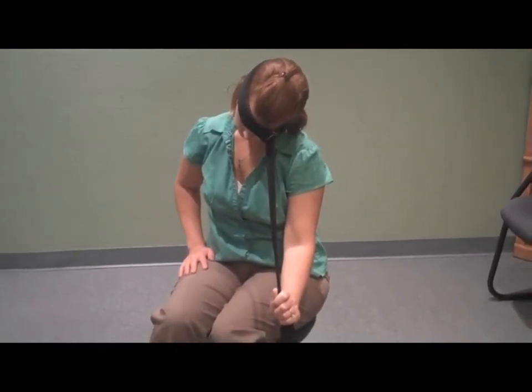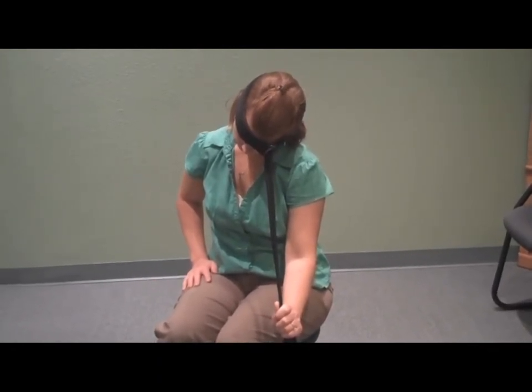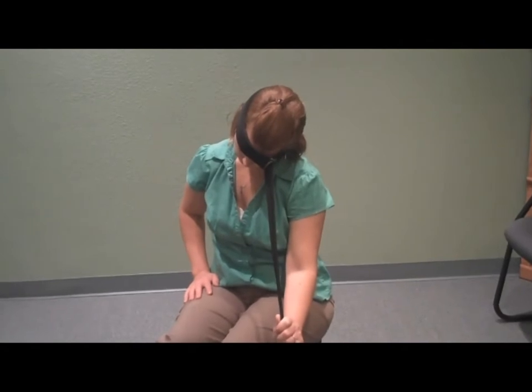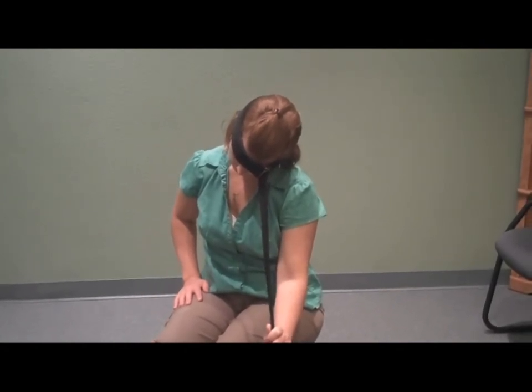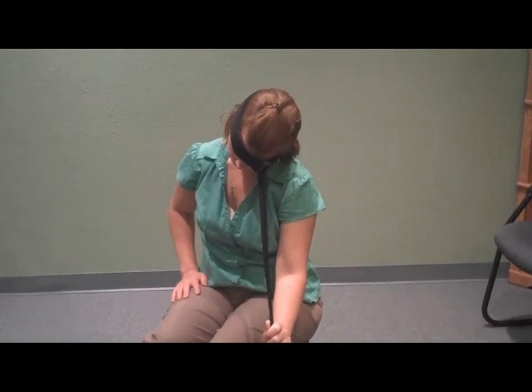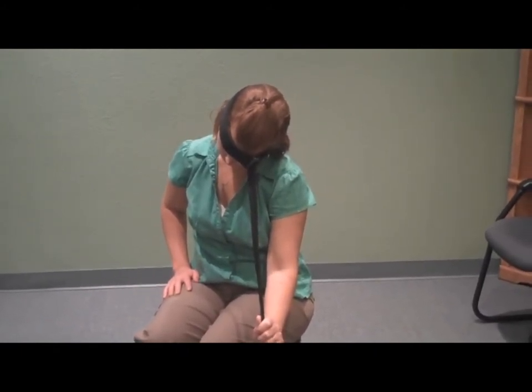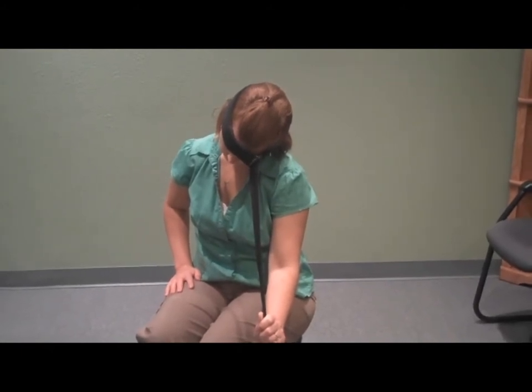You hold it for 40 seconds — 40 seconds is the key for each one of these stretches because that's when the fast twitch muscle fibers will become fatigued, and that's when it allows the joint spaces to open up to allow for more disc pumping and more disc rehydration.